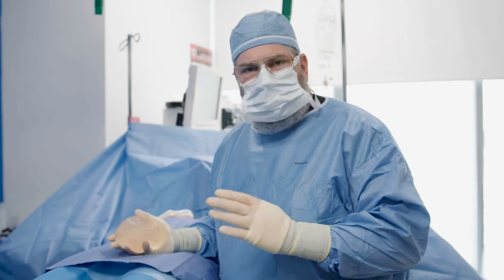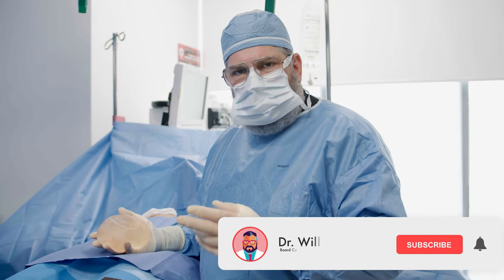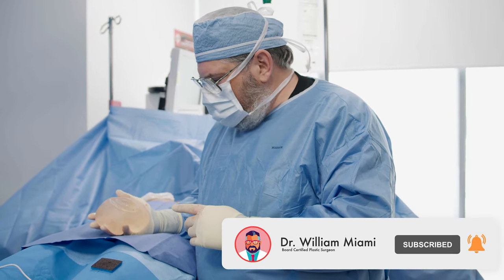I'm performing a breast surgery here where I'm exchanging implants and doing a capsulectomy, meaning there's a capsule around the implant that gets hard and distorts the breast. I've just removed these implants.